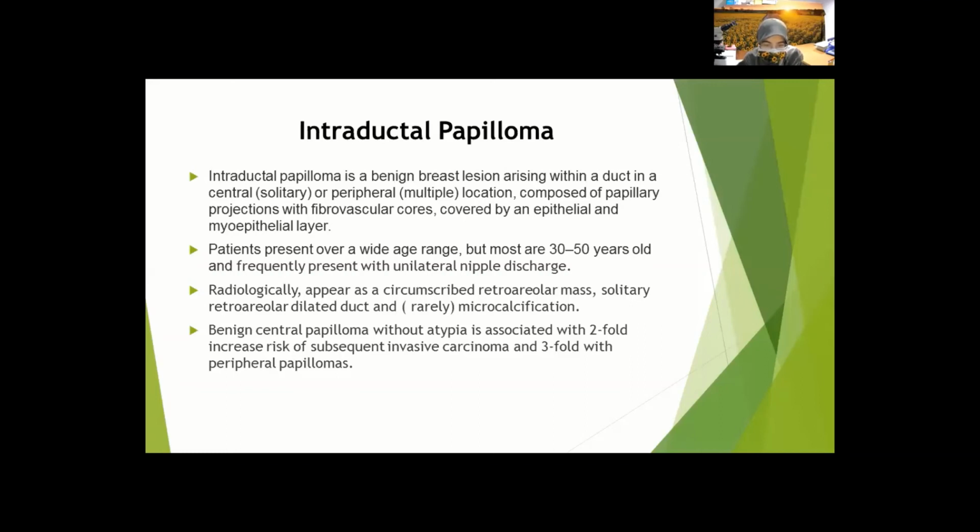Radiologically, it is a well-circumscribed retroareolar mass and can show a solitary retroareolar dilated duct, and rarely can have microcalcification. Benign central papilloma without atypia is associated with a twofold increased risk of subsequent invasive carcinoma, and about a threefold increased risk with the presence of peripheral papilloma.